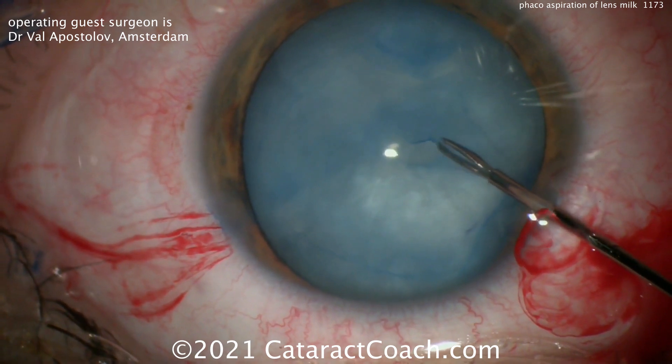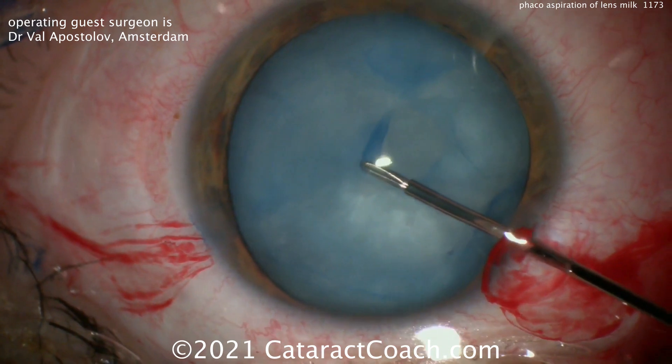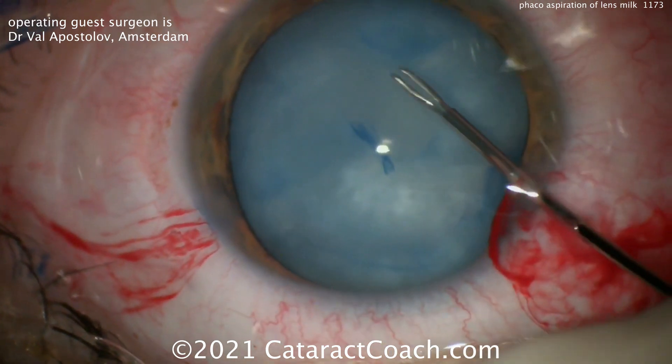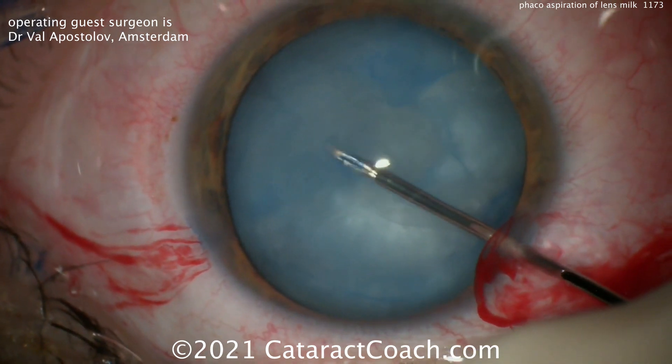Using these micro forceps — helpful here because you're just operating through a paracentesis, so there is no main phaco incision yet, just a small paracentesis on either side — and here creating a capsulorhexis.